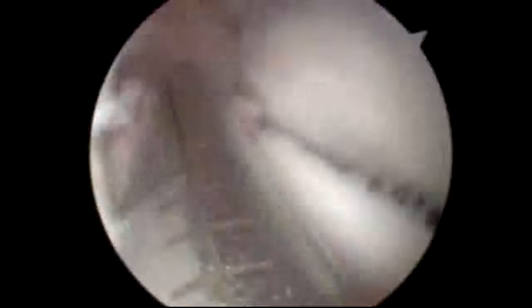You can see a lot of inflammation. That's that red seaweed-looking synovitis, which is inflammation of the joint capsule. So we're going to debride that with the motorized shaver and clean it up.